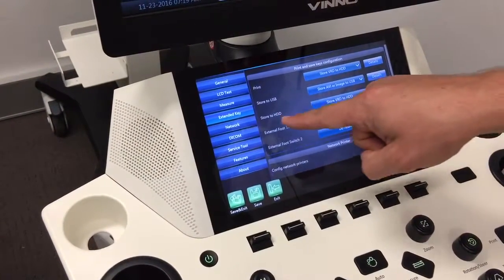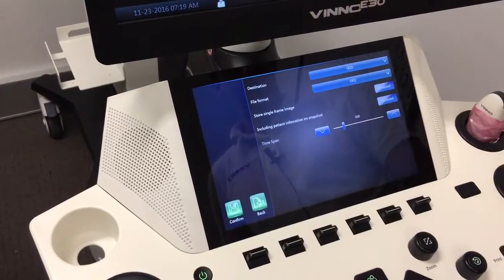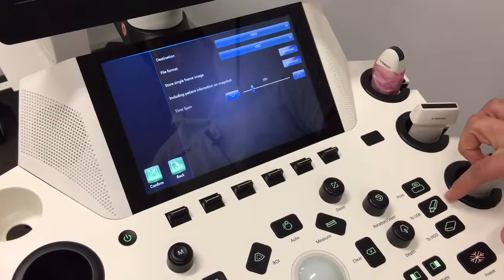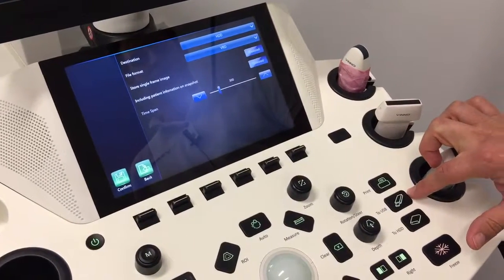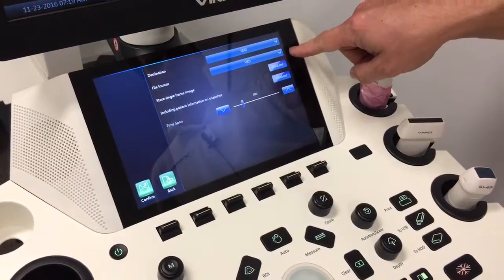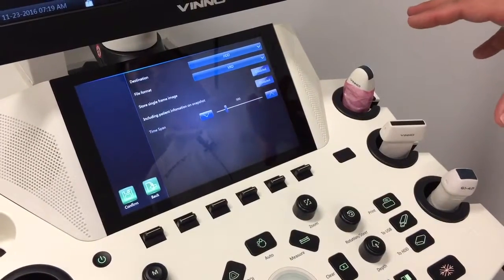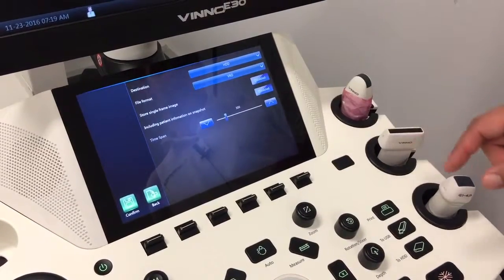Finally, you've got your store to HDD, which is again going to give you the exact same options. I like to keep this store to HDD key file format VRD, because you're going to be able to store AVIs to your USB and to your machine, and they're going to be able to easily get transported to your computer, whereas your VRD files give you a lot of post-processing options. So when you're in a hurry and you're just trying to get the images down into the machine and you might want to come back and have a look at them later or do a measurement or change some of the details, VRD files are the way to go.